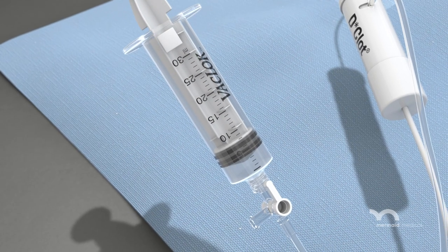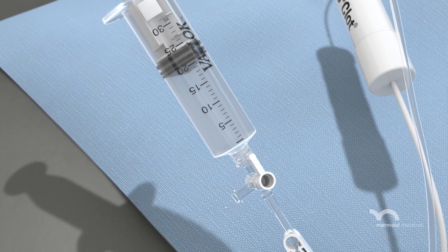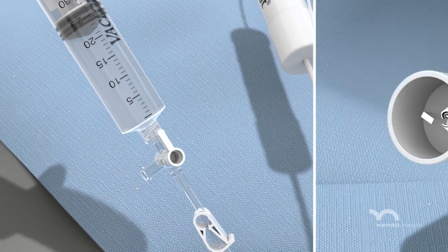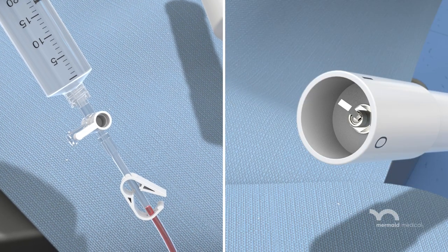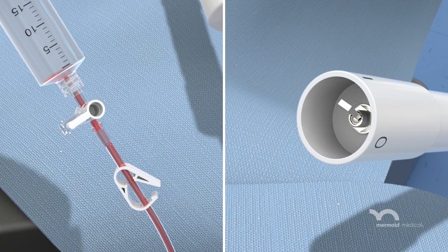With the clamp engaged, the syringe is being pulled back and locked into place. Activate the system and open the pinch clamp, releasing the vacuum and creating negative pressure at the distal tip.